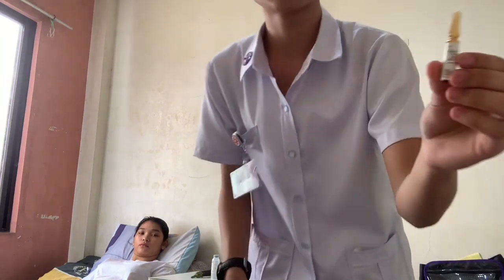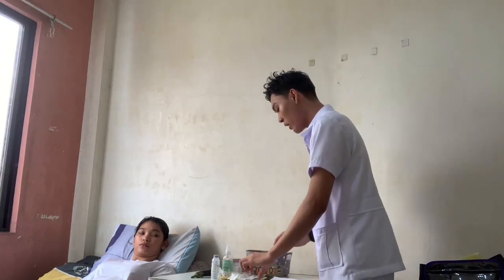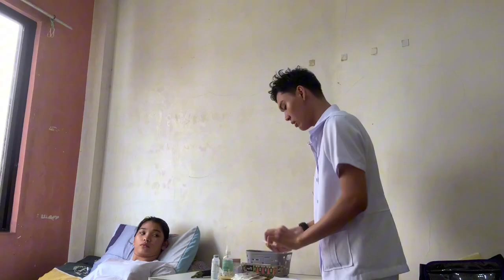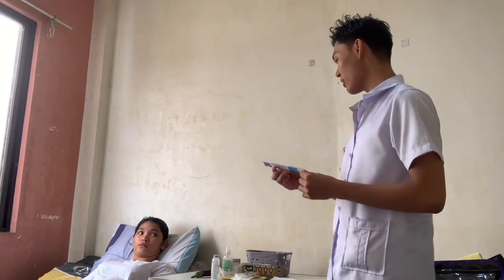I will now proceed in preparing an ampule. So this is what an ampule looks like. I have a 1 cc syringe. Since the syringe already has a needle, what I'm going to do is loosen it first so that I can connect the barrel into the aspirating needle.